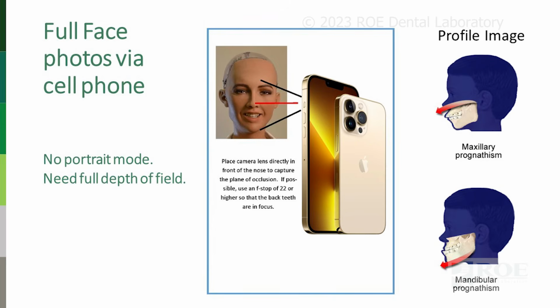Just a quick thing on photographs. We want really good photographs of the patient. A cell phone is fine, but full face, full smile. We want to see how the teeth, the lips, and the eyes look. Don't have the patient lying down, anesthetized, opening their mouth, trying to get a picture. Do it before surgery. Have them stand up against a wall, smile, tell them something funny, and get them to smile naturally with normal gravity affecting their lips. If they're lying down in a chair, turning over to the right, looking at you with a smile, it's not good. Have them stand up. All right, that's enough on that.